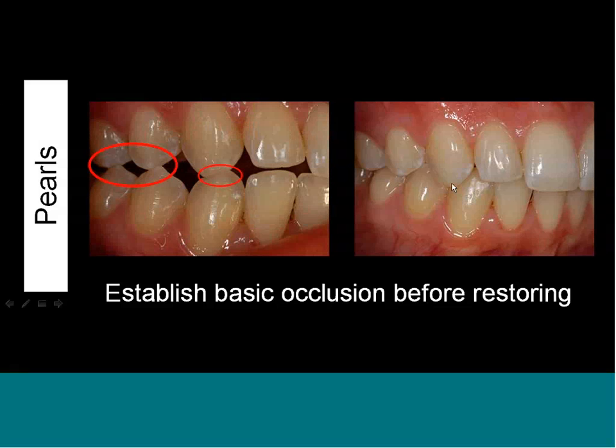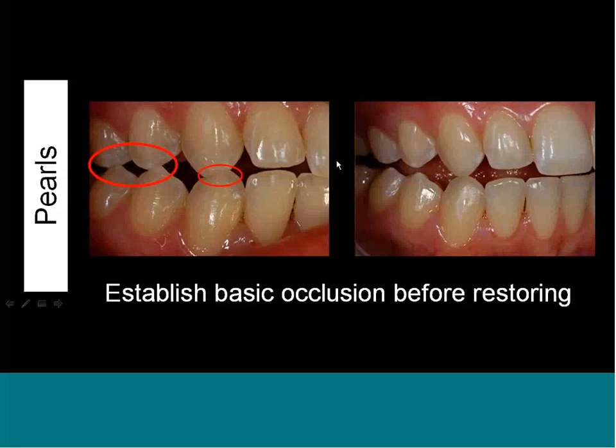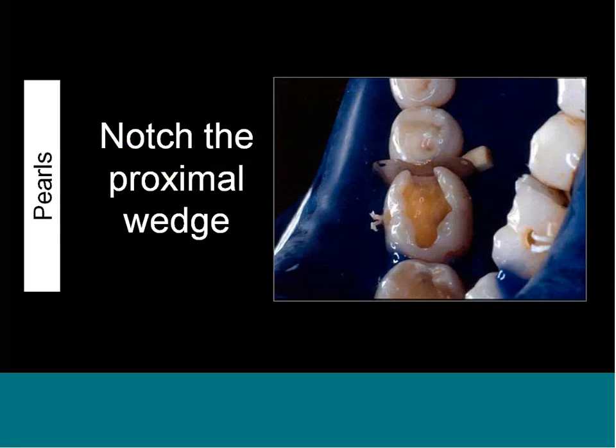And after, here's, I've added a little bit of composite just to the canines. And now the patient goes into canine rise and they've got disclusion instead of group function. So now the molar that I'm working on in the back next, I have more freedom in terms of the anatomy that I can do there.